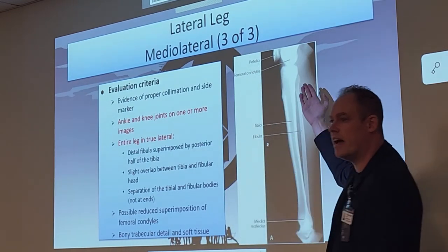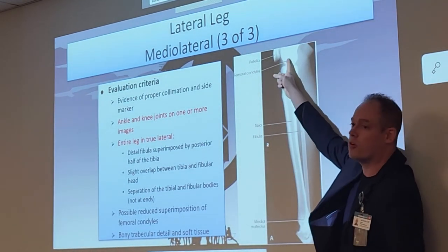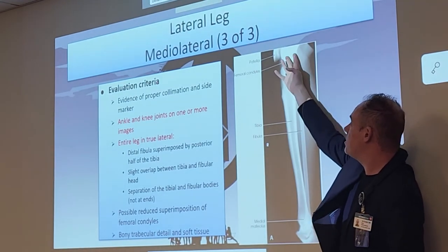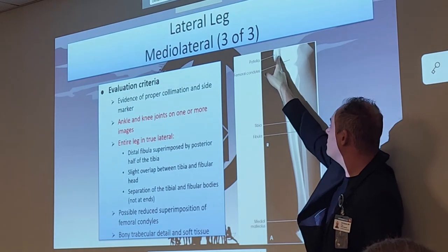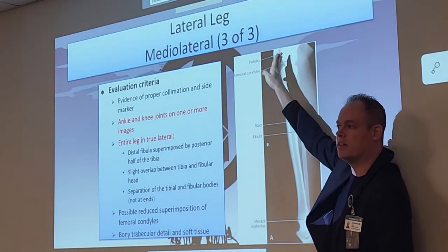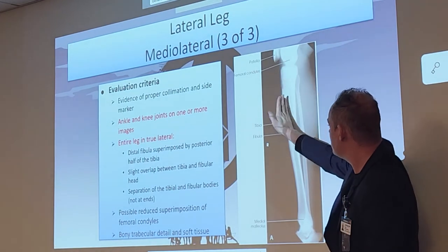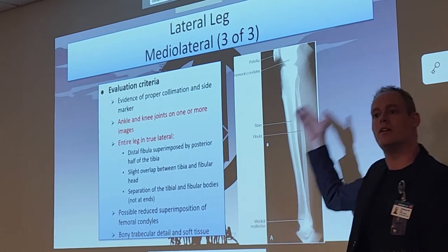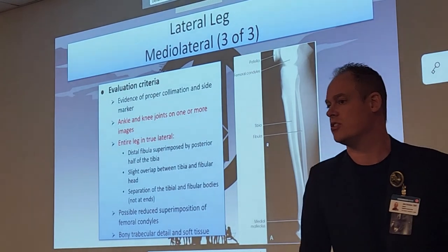Here's a nice true lateral example. How do we know? Look at those femoral condyles — see how superimposed they are? If it were rotated and the condyles separated, we would also see the knee joint closed off. Patella is in a nice true lateral. Tibia is in front of the fibula. Nice true ankle joint as well. A lot going on in that image that we can check.